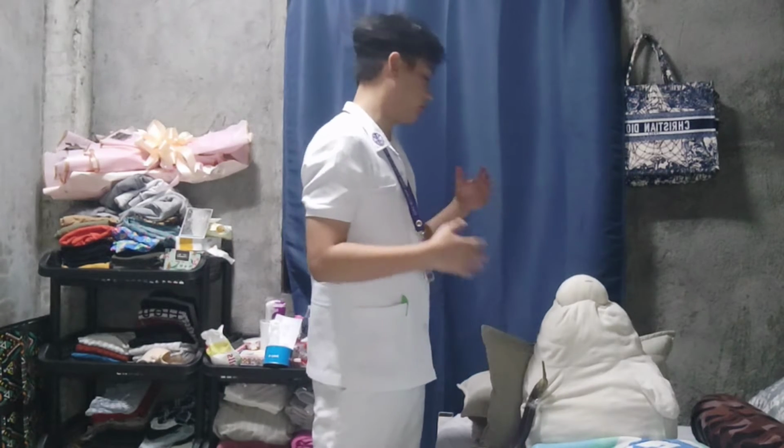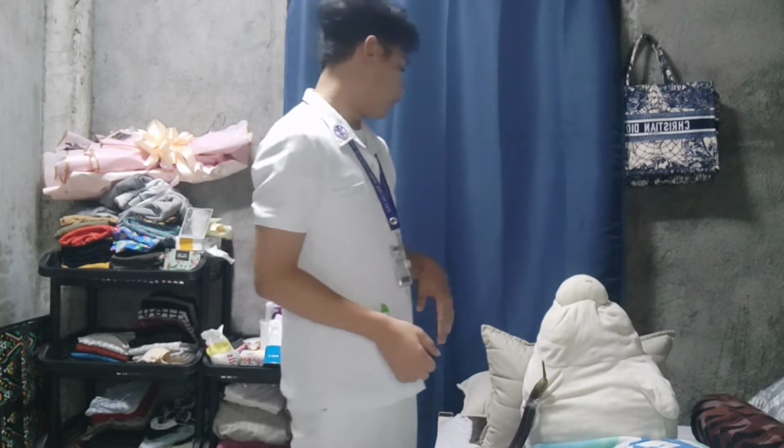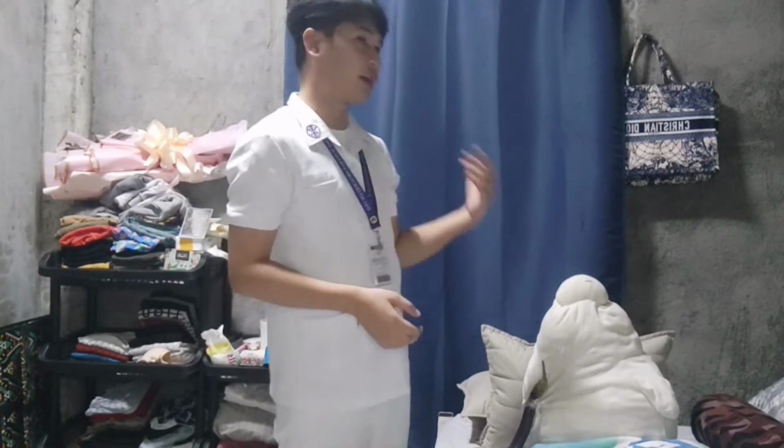This is to ensure the patient is ready for the procedure. So, preparing the client. Because the patient is in a sitting position, we are going to administer the medication into her arm, particularly in her deltoid muscle.